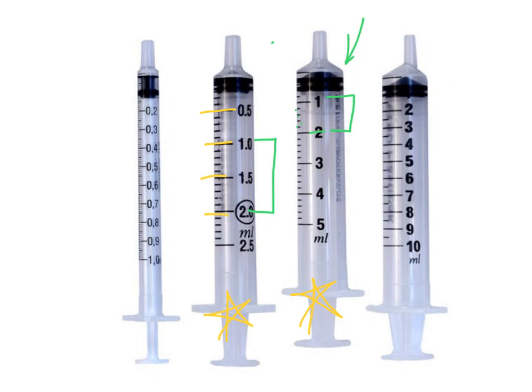We'll see the same thing between the 2 and the 3. This would be 2.2, 2.4, 2.6, 2.8. That's why this is 3. And we could keep going, so on and so forth. I can't do that on that second one on your screen, because if we did that, say I'm starting here at the 1, if I said 1.2, 1.4, 1.6, 1.8, this would have to be 2, but instead it's 1.5.